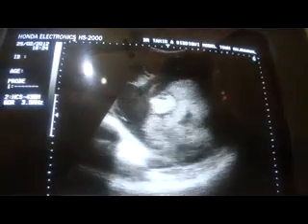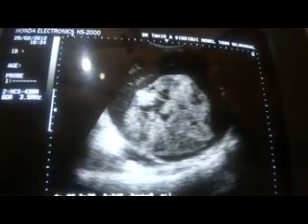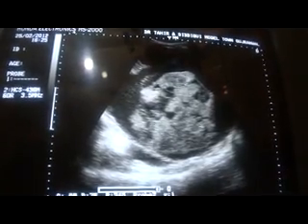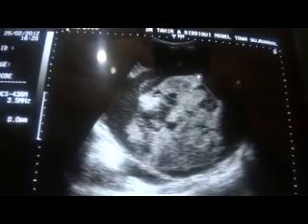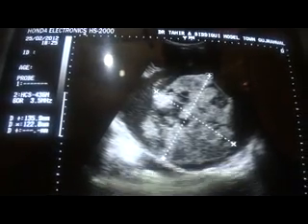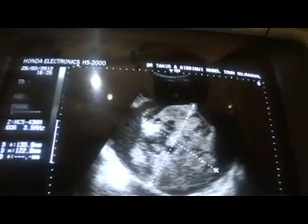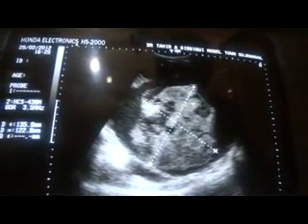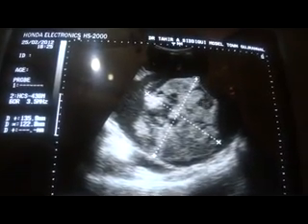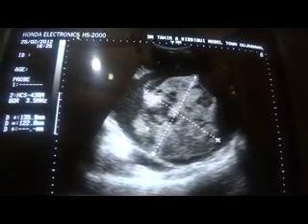No shadows from any of these ball-shaped structures within the cystic mass. This one, I am talking about this one. This is a ball-shaped structure, this is a ball-shaped structure, these are all globular, thick, densely echogenic areas with fine internal septa. This is a septa and internal echoes.